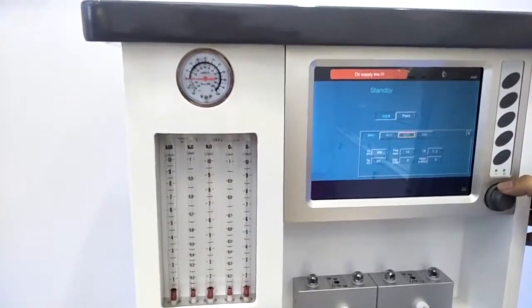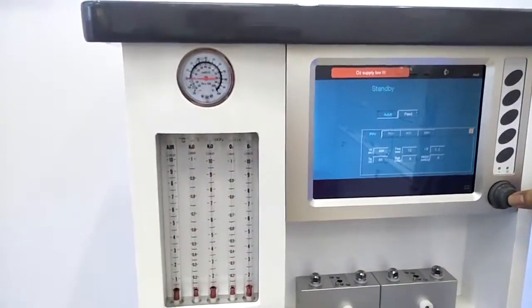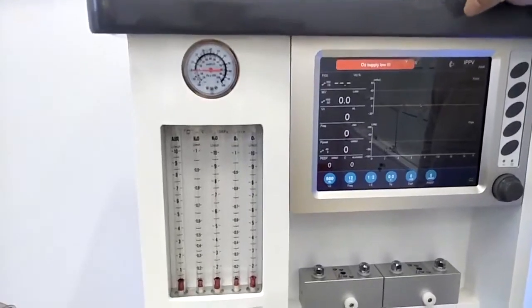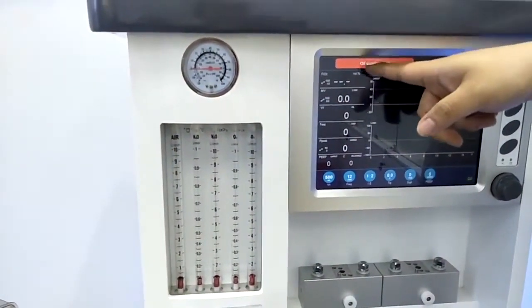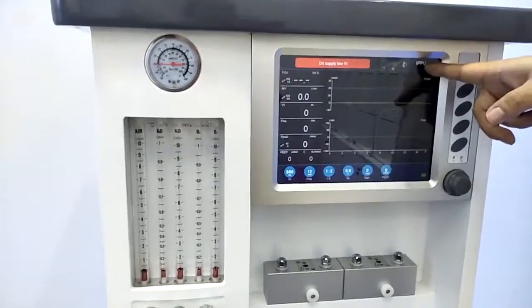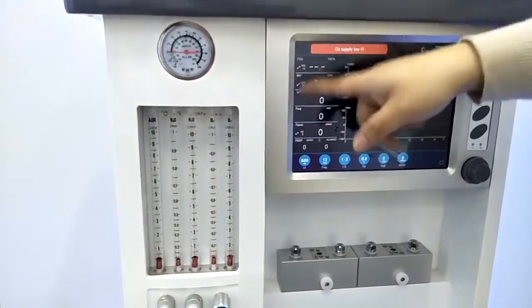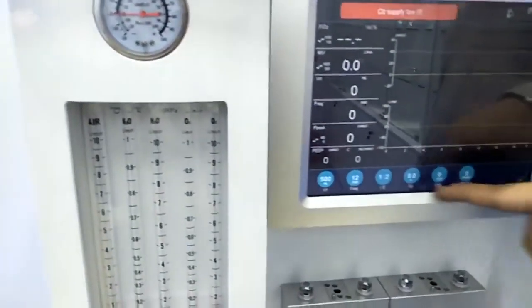Once we set all the parameters, we just move to here and press the rotate button again. Then we will get into the main interface. And under the main interface, we have four parts. The top side is the alarming area, with red and yellow colors for the alarms, and also different frequencies of the voice. And here is the ventilation mode we are choosing now, and it will show for adult use or children use. The left side here is the monitoring parameters, and the bottom side is the adjusting parameters.